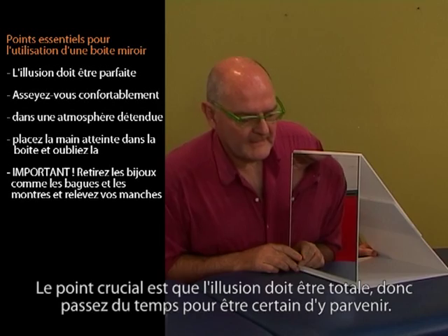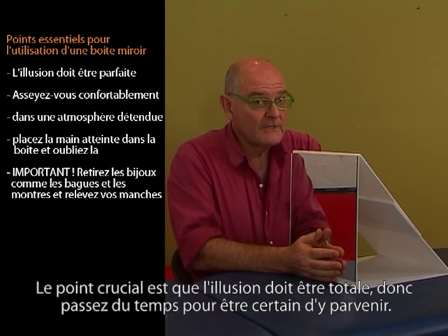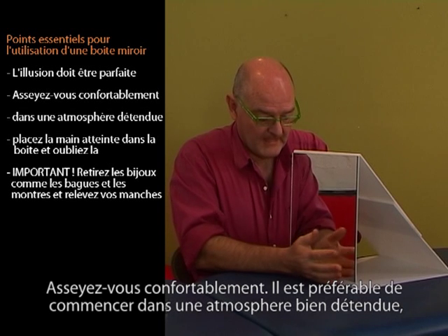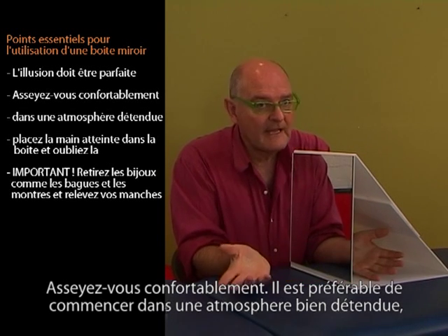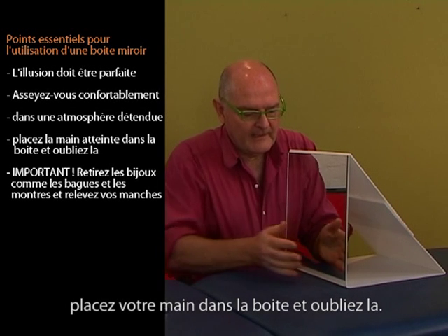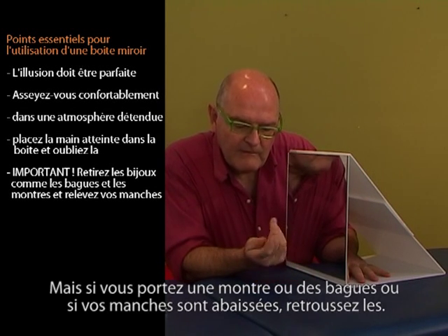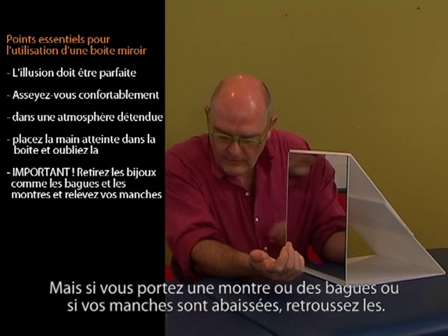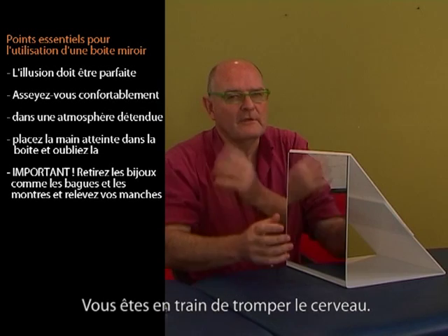Okay, a few points about using the box. The key point is that the illusion must be complete. So spend some time making sure it is. Sit comfortably. It's best to start off in a nice, relaxed atmosphere. Put your hand in the box and forget about it. But then if you have any rings or watches, or if your sleeve is down, take them off.